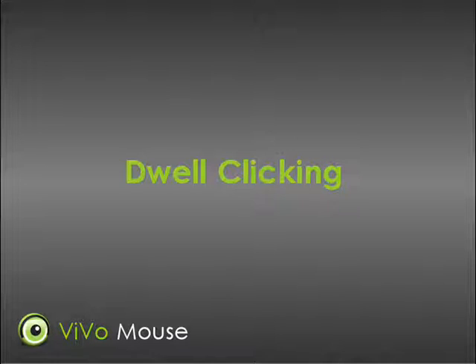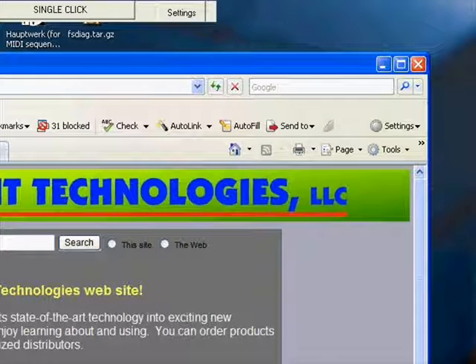There are other ways to click with the VivoMouse. For example, if you don't want to use speech recognition, you can use dwell clicking. Let's say the VivoMouse is in dwell clicking mode and you want to click on the close button of Internet Explorer. You would move the pointer to the red X, and with dwell clicking, you hold it there until the click automatically happens.